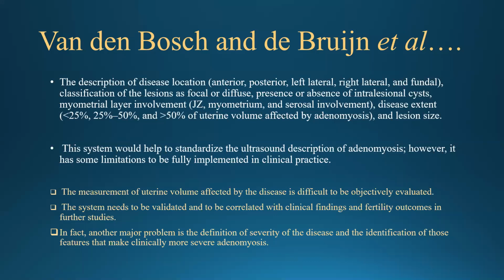Then they come to the disease extent, and they have to give a comment about whether it is less than 25%, between 25 and 50%, or more than 50% of the uterine volume affected by the adenomyosis, and the lesion size. The system would help to standardize the ultrasound description of adenomyosis. However, it has some limitations. We cannot fully implement it in clinical practice because of the following reasons.